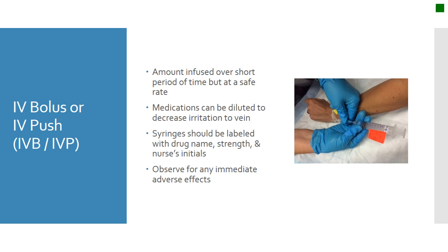Sometimes, and a lot of times, we dilute medications with normal saline. The syringe says normal saline, but I have added morphine to it. If I leave that medication on the bedside table, another person may think that it is only saline solution if it is not labeled, even though it technically is diluted morphine. It is very important to have your medication syringes labeled.